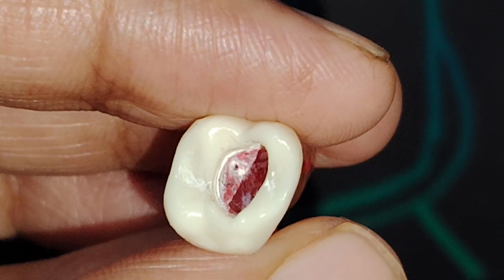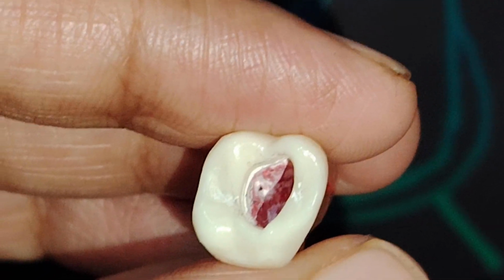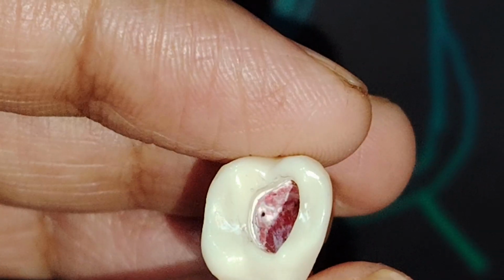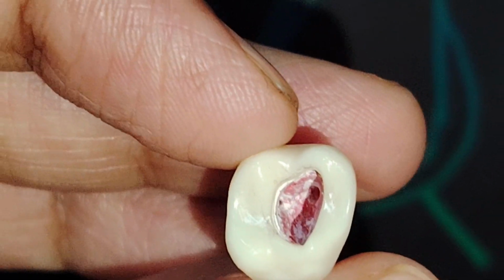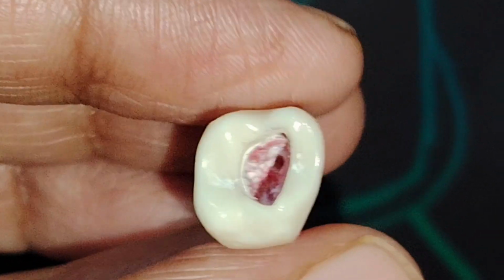The one that is hidden is basically the distobuccal orifice, which we will not find under the distal cusp. We'll not find it here, we'll find it somewhere in the middle. So we should not go beyond this oblique ridge for access preparation, because we'll not find anything here mostly.